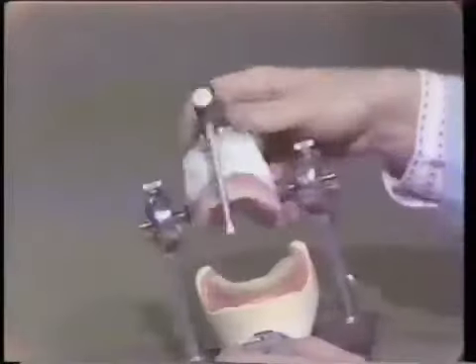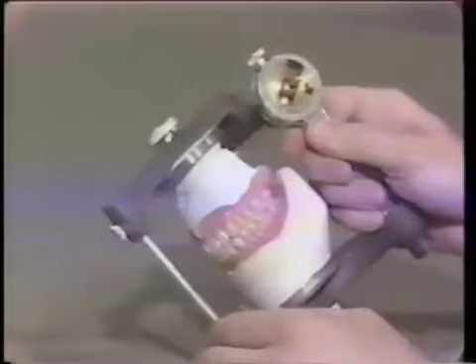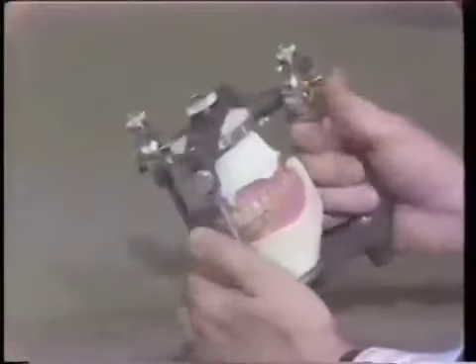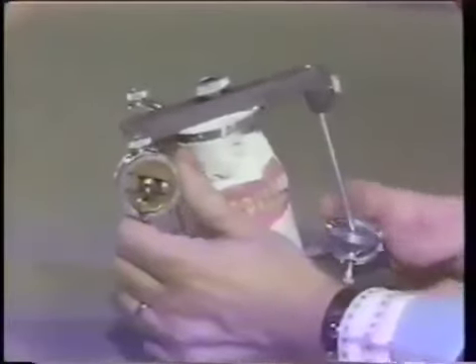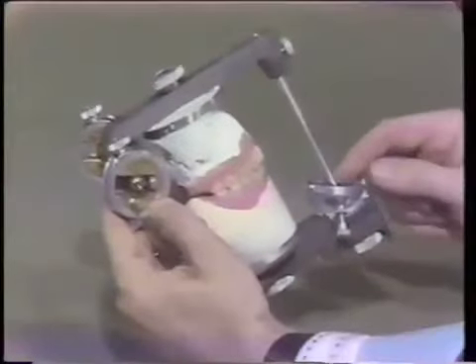We're just about ready now. One other important thing is to make sure that the condylar determinants are correct. Remember that we're not using the 20 degrees we had on the immediate denture, but 30 degrees for these teeth. So set both condyles back at 30 degrees, set the Bennett angle at 15, and make sure the incisal table is moved from 20 back to 30 degrees. This isn't as important now because our incisal guidance is actually determined by the teeth that have already been set and processed.